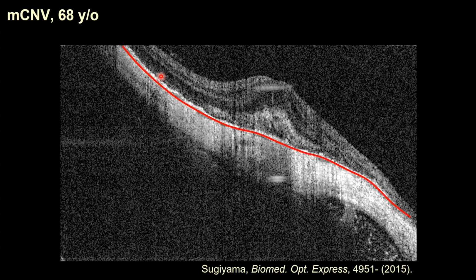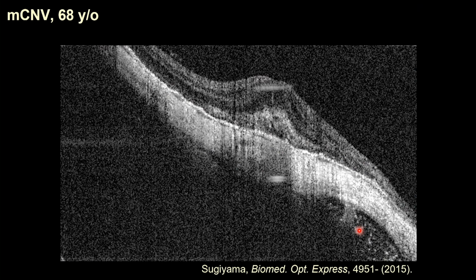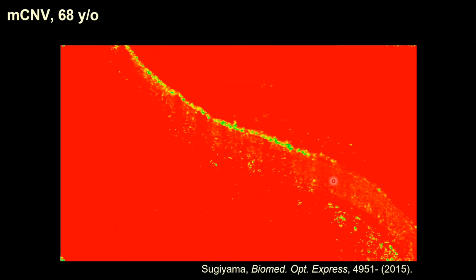By turning on the polarization uniformity, we can identify where melanin exists. What is important here is that in this standard scattering OCT, we see the retinal pigment epithelium. Well, at least we had believed we saw the retinal pigment epithelium. But by turning on the melanin signature, we can see that there is no melanin at the right-hand side. The tissue has already been damaged. Okay?